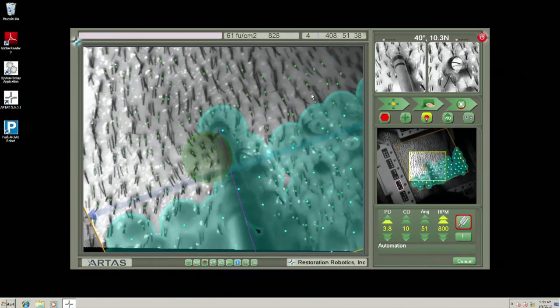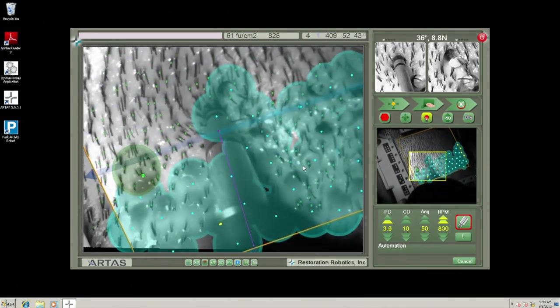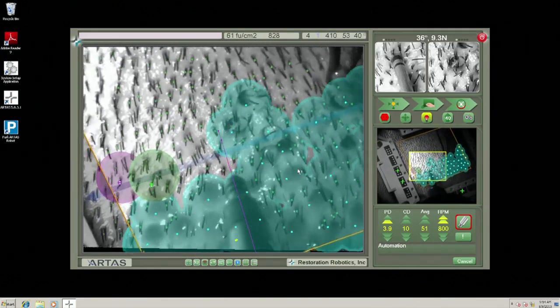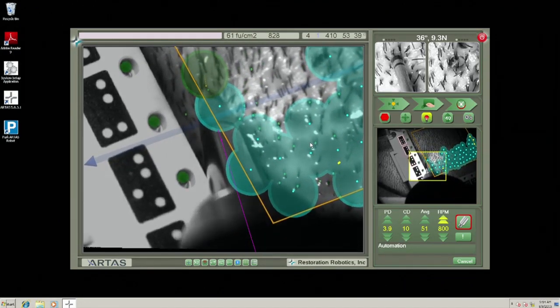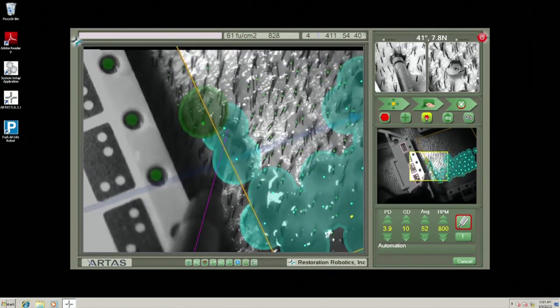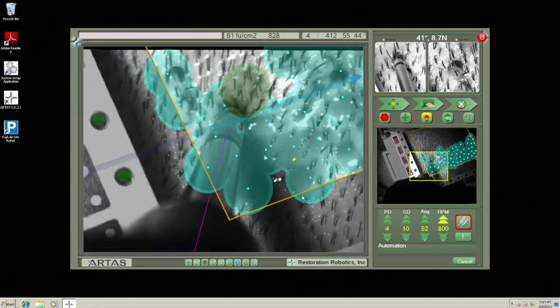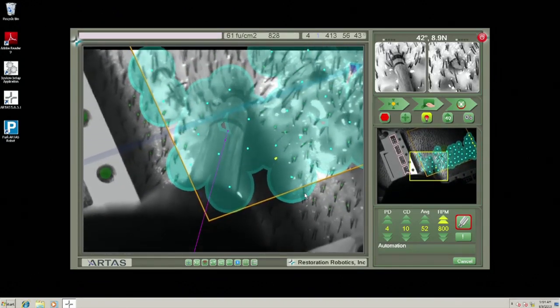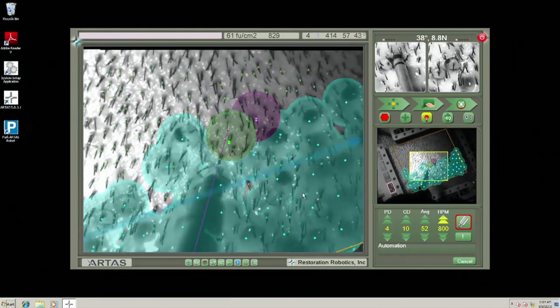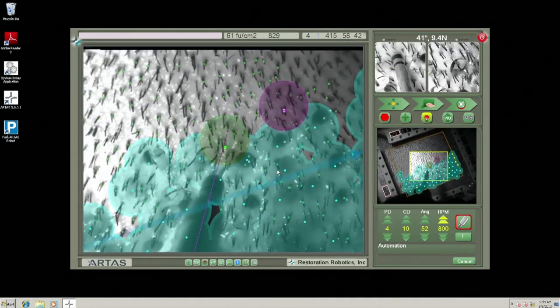So we do have a backup generator that will kick in, and there are certain outlets throughout our operating room that are plugged into it. They're usually signified by a red outlet in the United States. We have to do that as part of safety backups, and so yes, fortunately, if the power does go out, we do have an emergency backup system in place, and emergency lights do go on.